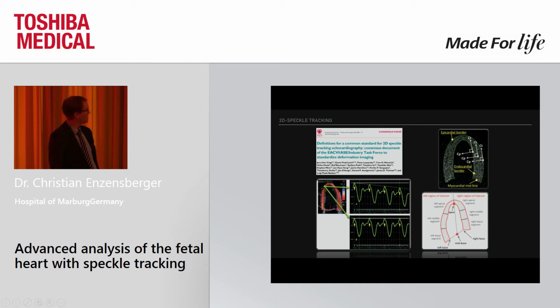The different vendors and industry said, for example, that longitudinal strain is based on the endocardial border tracking. Even different vendors, for example, include their whole wall motion tracking, but it's mainly based on the endocardial border tracking.